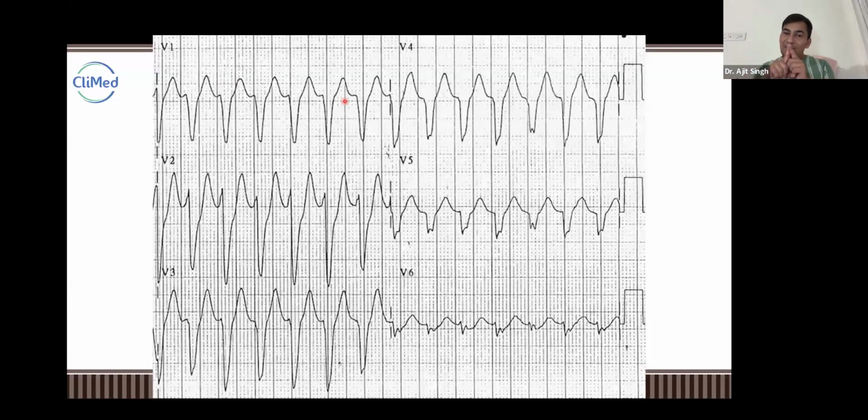But here, in the negative and positive concordance, it is very important. Usually from the Purkinje fibers, it goes left side, right side, from the RBBs, LBBs, going down and to the upper side, and both sides it is completely going.